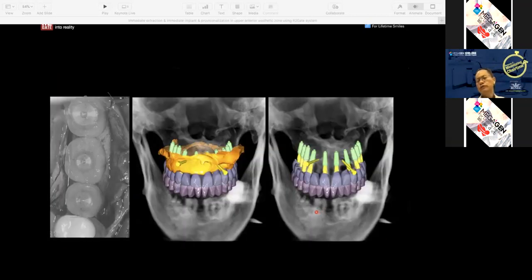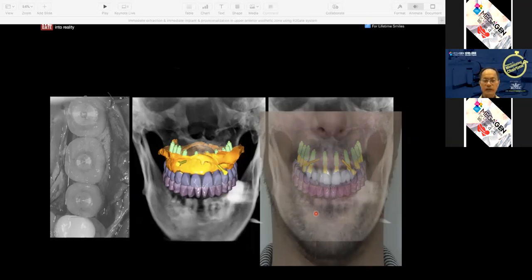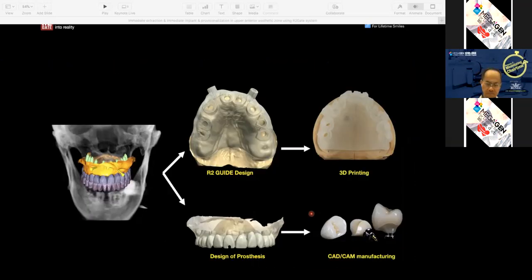All right. So how do we do this? We are going to share with you a clinical case on how we can achieve this. Let's say we have solved this with CBCT, and we have the DICOM file. When we get the final file, and we know that our precision is under 30 microns, we can now plan a position. To produce this guide, if we were to use a conventional laboratory system, we again have the error of the shrinkage of the acrylic. But if we were to use 3D printing technology, again, our precision is a lot higher.